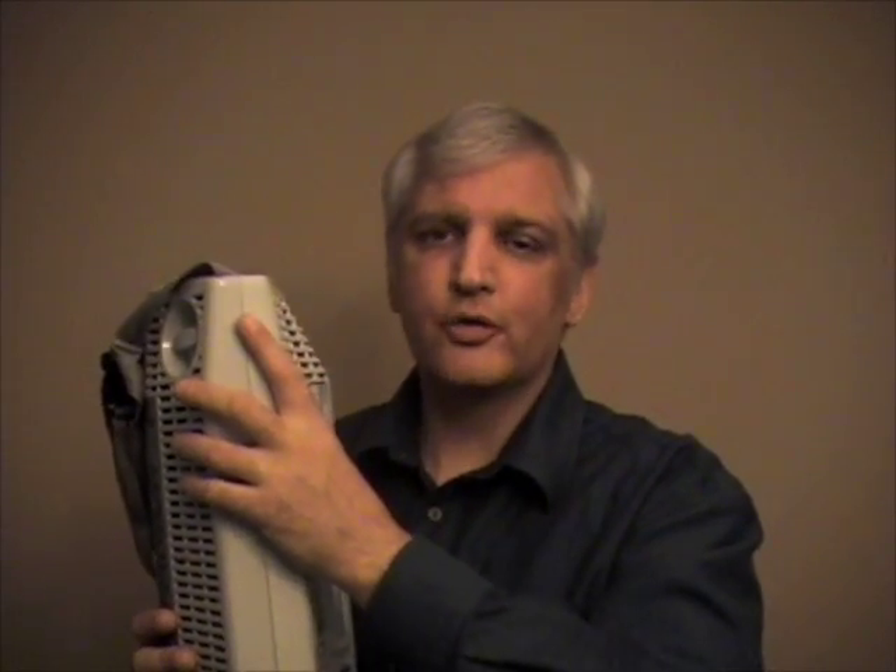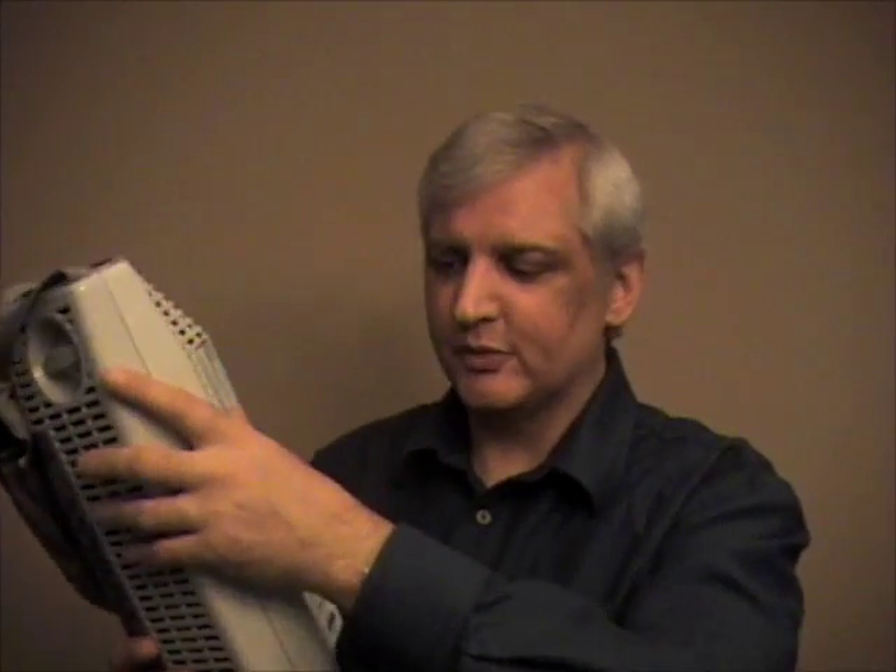You don't want to be sticking your fingers inside any of these cracks because it does get really cold in there — like over 185 degrees below zero.